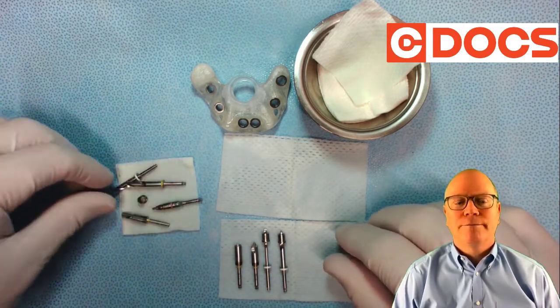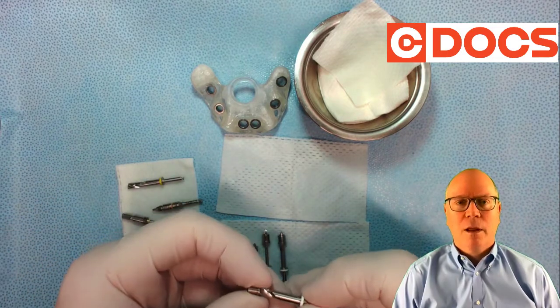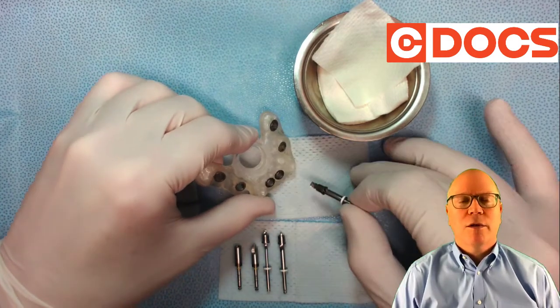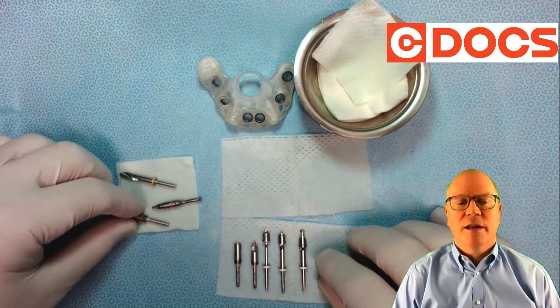Now the number four — I'm going to put that same sleeve on that. Check that again in the guide. You can do all this also while the PRF is spinning if you're doing that, or while the patient's getting numb.